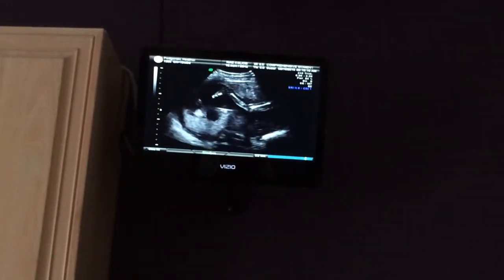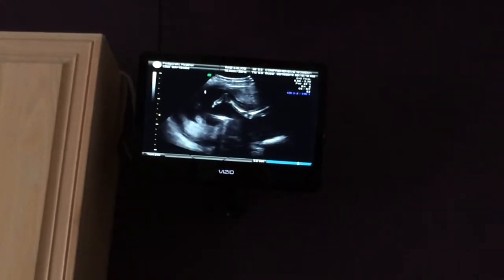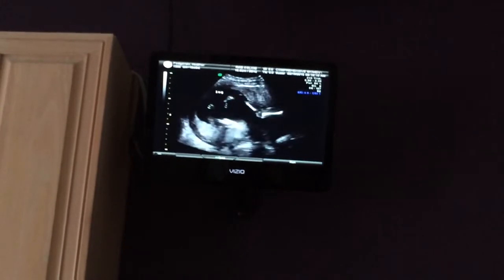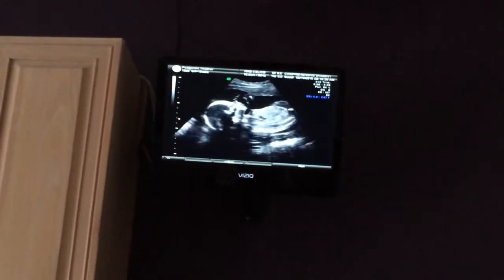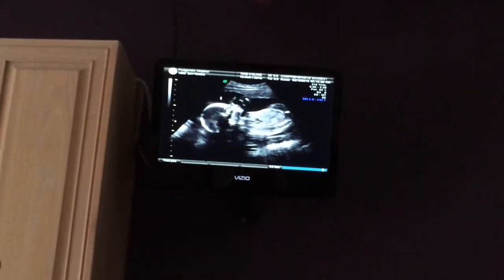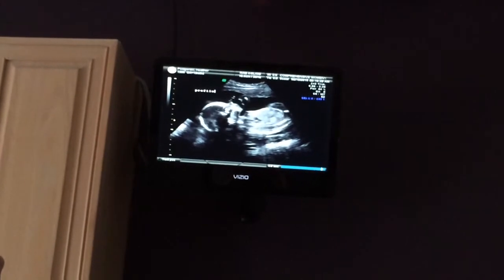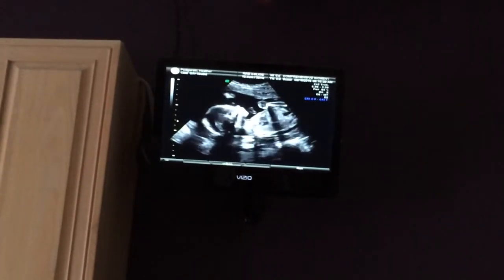Little leg — you can see it from the side. Let's see if I can get that profile now. It looks more baby-like from the side. That's cute.